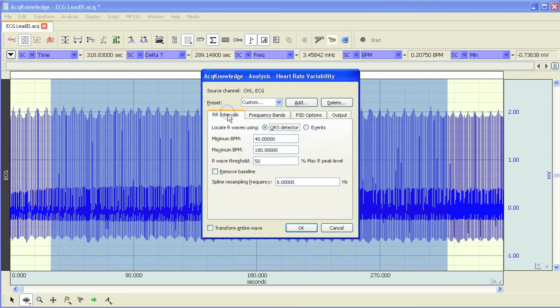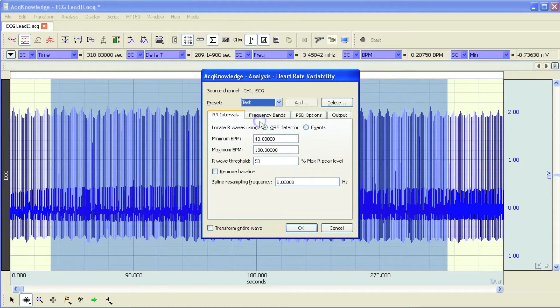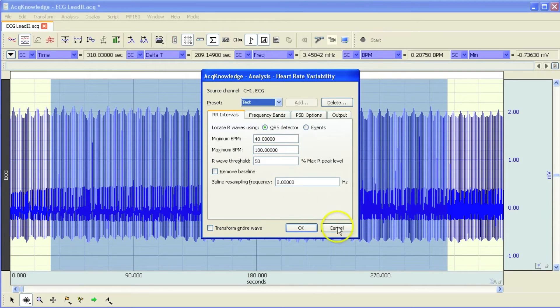We can also output the results so that they're pasted into the journal for further use. And then you can also show the spectrum as a new graph window. If we come back over to our setup here, you can see we've got it set.